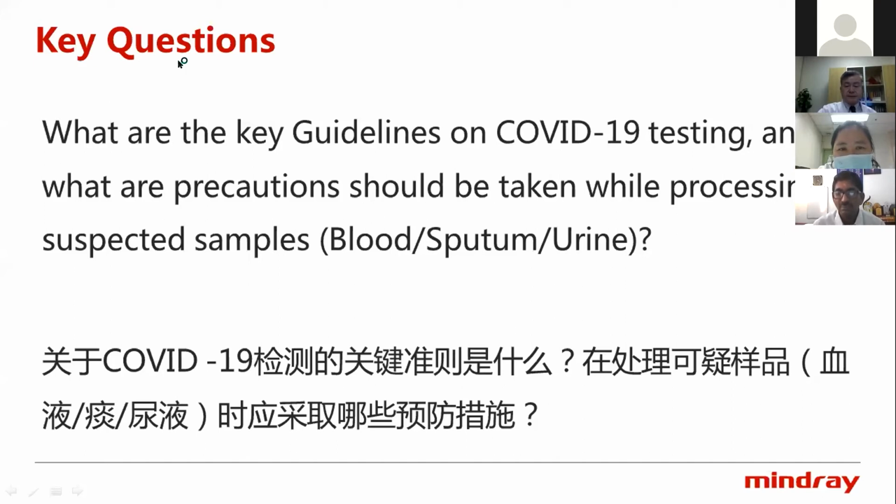On nucleic acid tests, this is another major part. For nucleic acid tests in China, our requirements are very stringent. Theoretically, 3 zones, buffer zone. We need to have the reagent preparation zone, specimen preparation area, and amplification area.